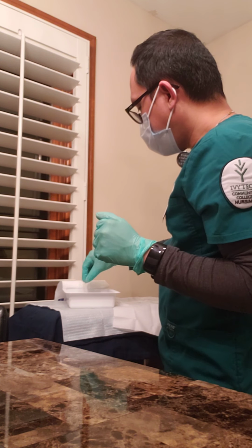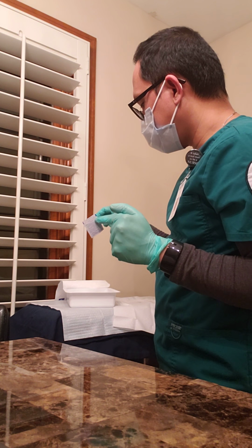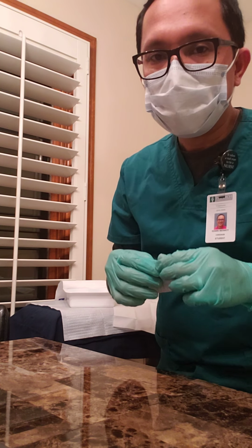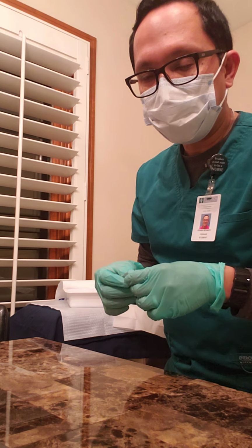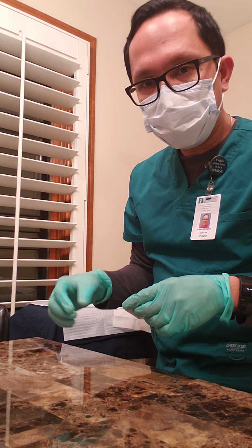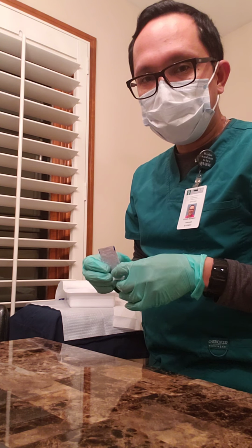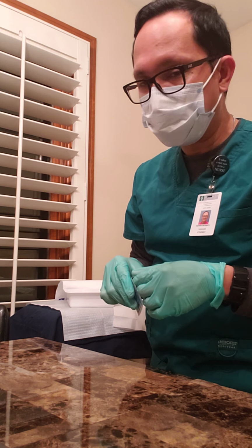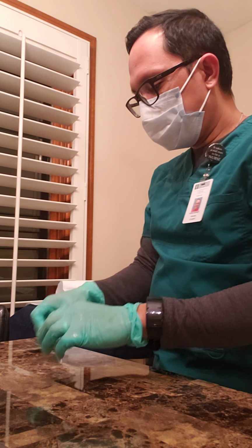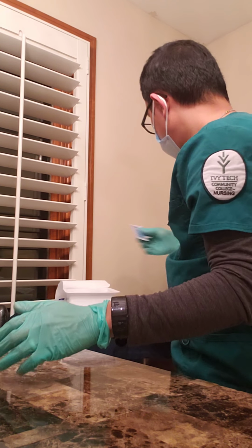And then at this point in time, before we put the transparent dressing, you want to make sure you wipe the edges where you're gonna be putting the dressing with the skin prep, just to make sure the dressing sticks in there and doesn't come off. So I pretend I opened the skin prep, and then I just wiped the sides, the edges.